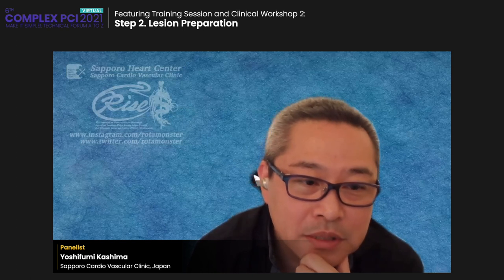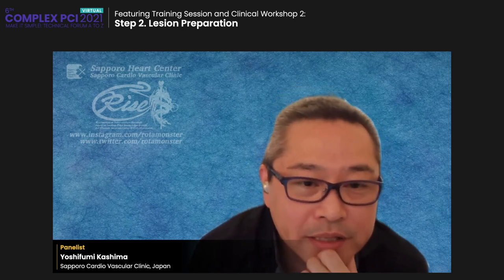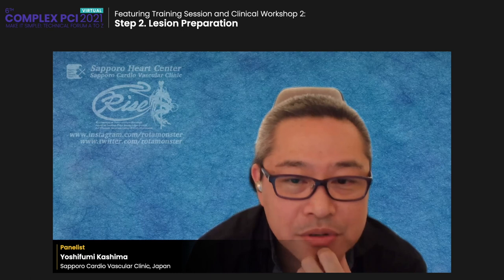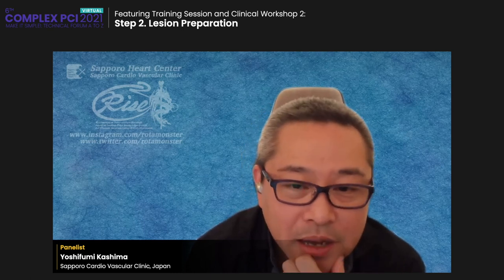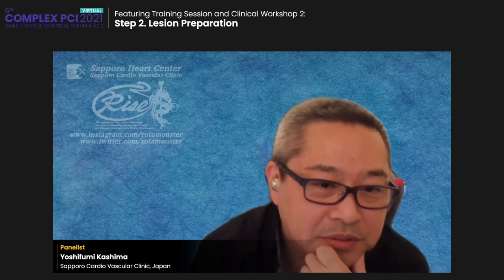Because IVL is not available in Japan now. Of course I want to use the IVL, however not. As for orbital atherectomy, I don't believe in the differential sanding mechanism. I think the debulking device needs a safety mechanism, and I don't find any physical law supporting differential sanding. So I always use the rotational atherectomy.